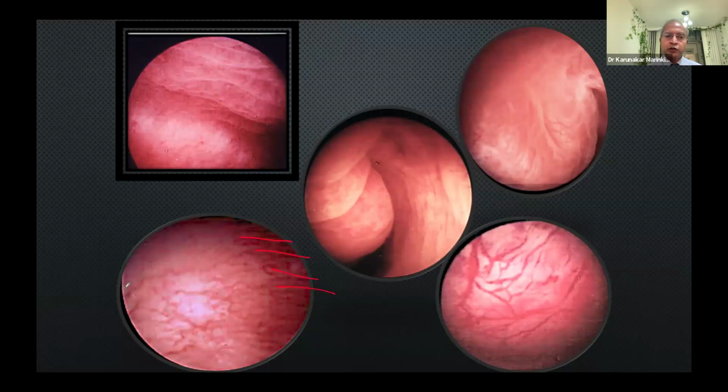But here, if you see, it's almost chronic inflammatory. We call them telangiectasias secondary to surgery. So there is no chance she will have implantation. But she had a successful submucous fibroid resection.